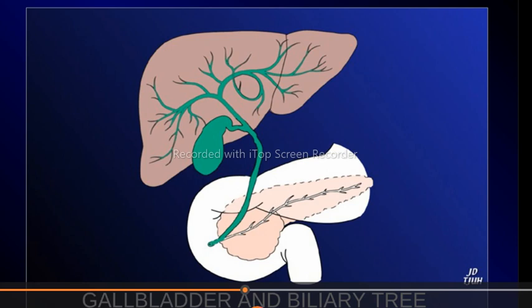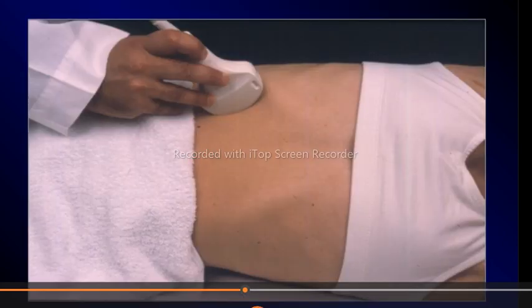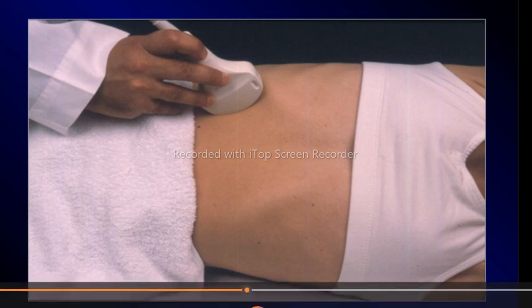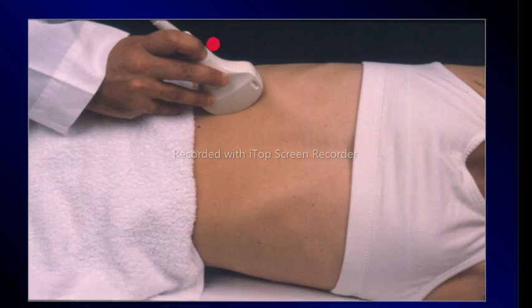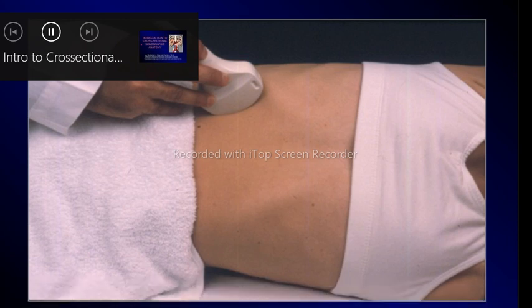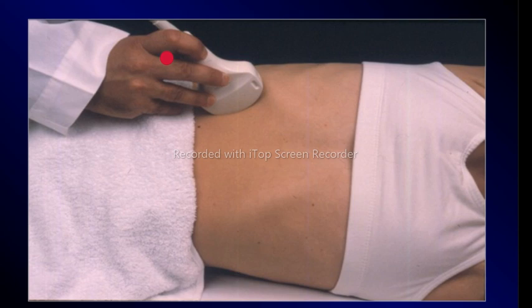Then we come to the system. This is a patient in the left posterior oblique position. Left side is down and oblique because it's not a true decubitus. So in this position, the gallbladder falls forward and it becomes easier for us to see. Probe is put in that position, and sometimes we make small adjustments because the gallbladder does not fall in the way we expect.